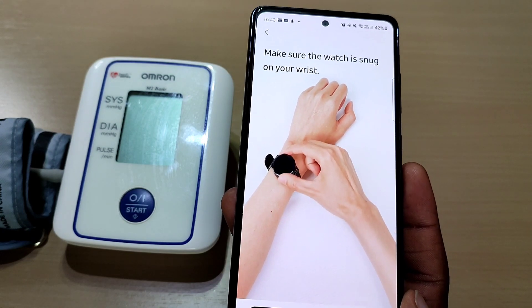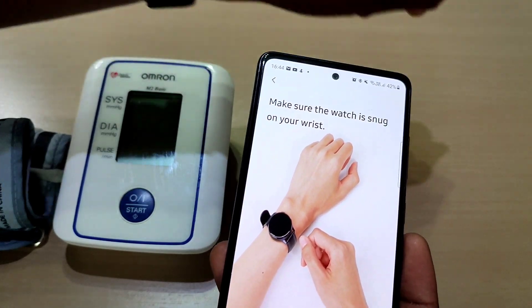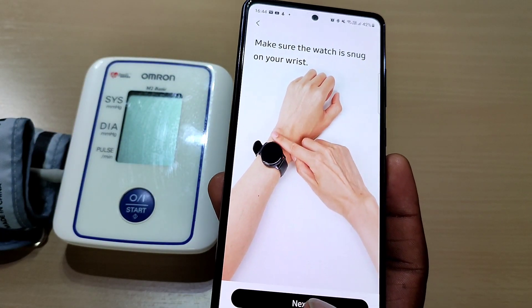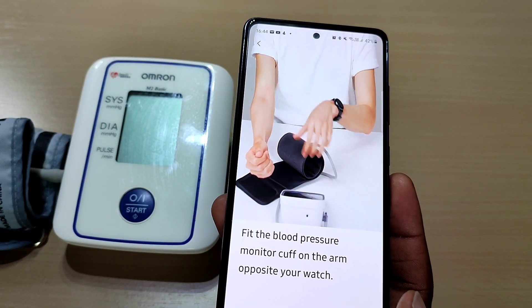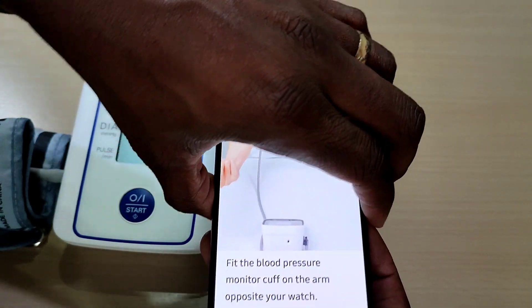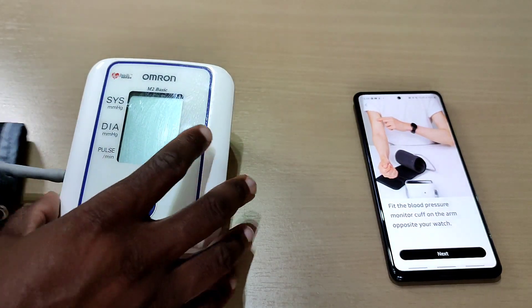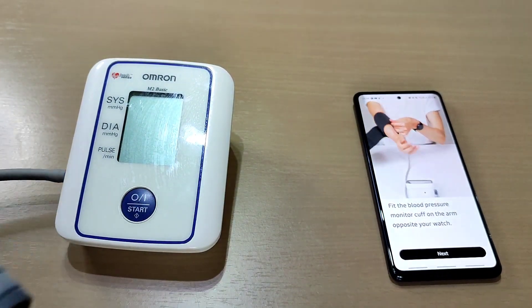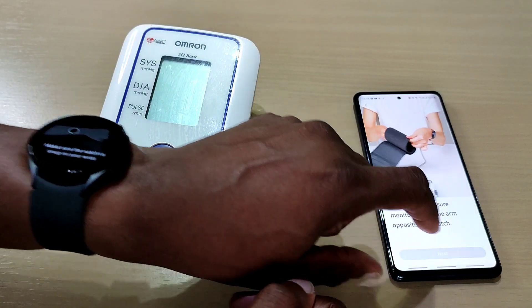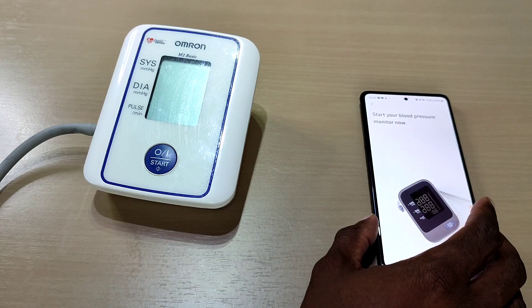Make sure the watch is snug on your wrist — yep, that's pretty snug. Flip the blood pressure monitor cuff on your arm opposite your watch. Put the cuff on and start your blood pressure monitor now.